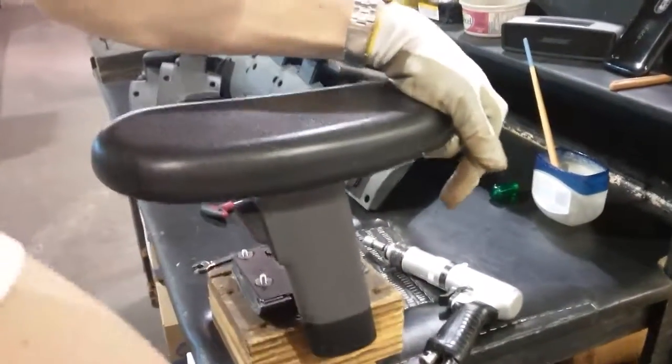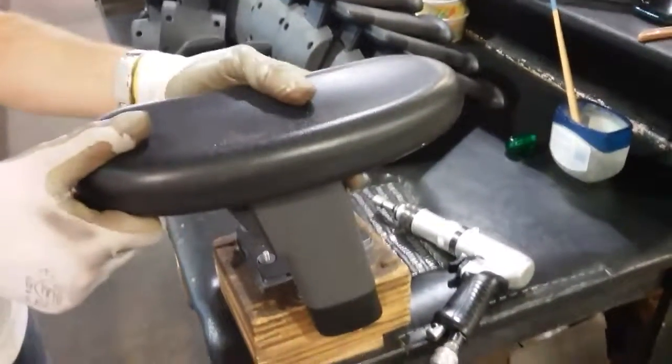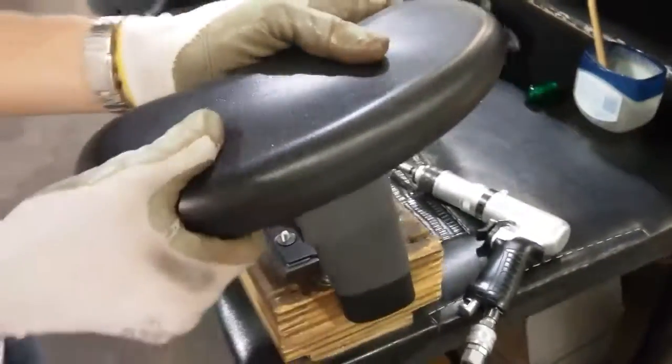and that's as easy and as simple as it is to access the arm pad. The 3D arm pad by Nightingale for any concerns, any new parts you may need to put in there. Thanks everybody.